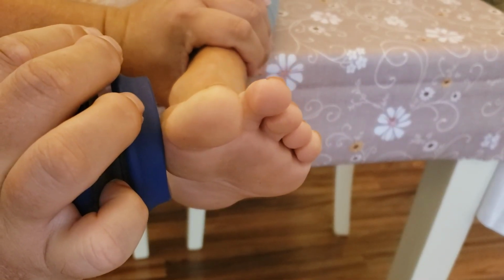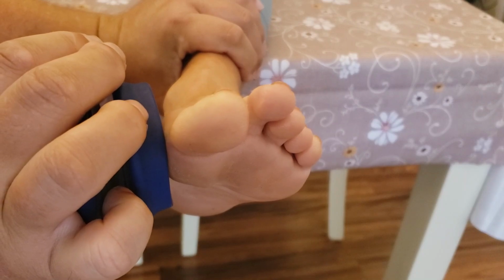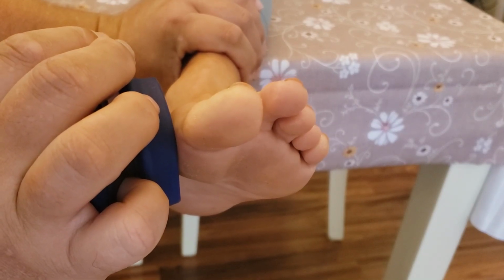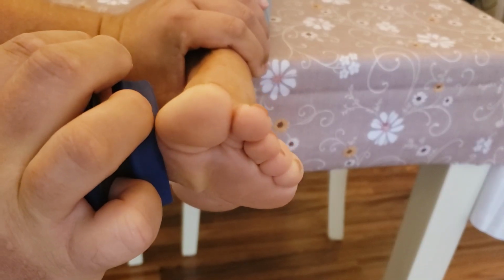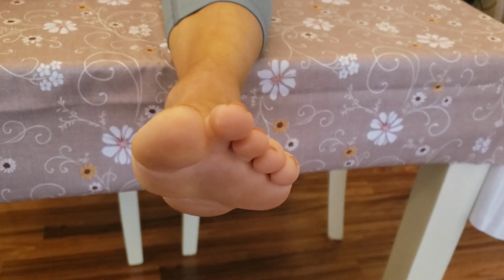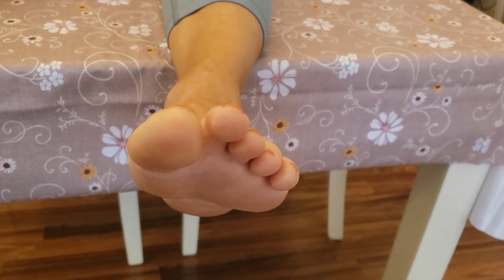I'm going to give you about 5 seconds, and you're going to push, push, push, push, push until I say stop. Ready? And go. Push, push, push, push, push. Good job. We would do that 3 times just to make sure we're getting 3 readings that are very similar. And that's our handheld dynamometry for ankle inversion.